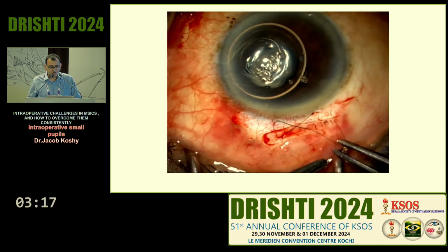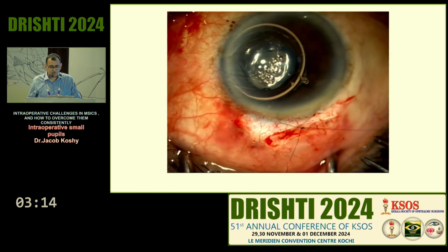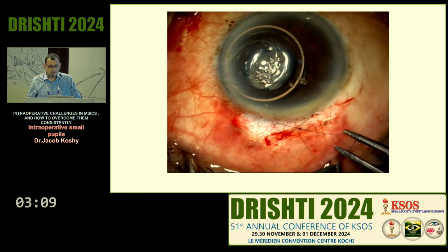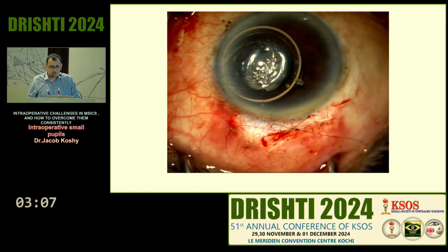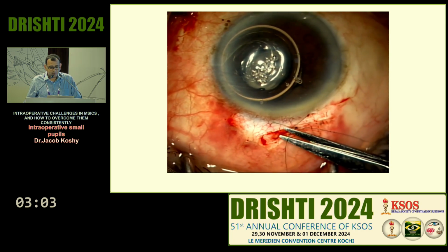One thing that you will notice is the air bubble is pretty stable and it's not leaking out. That itself is a good sign that the anterior chamber is good. The IOL is in position. Everything is fine, and yeah, you can close the case.